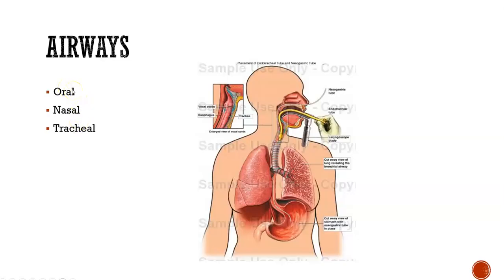Most of the time, the rule of thumb is if we can't get somebody extubated, meaning we can't get that ET tube pulled out and get them breathing on their own within about 2 weeks, then we typically start talking about putting in trachs.